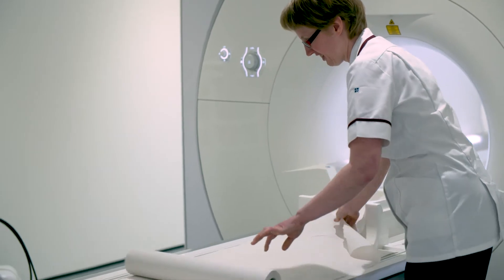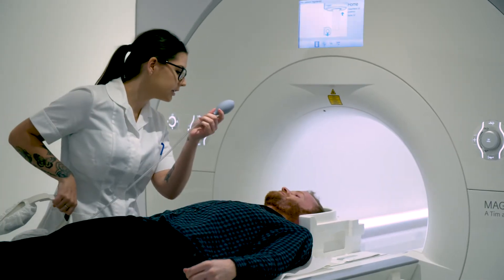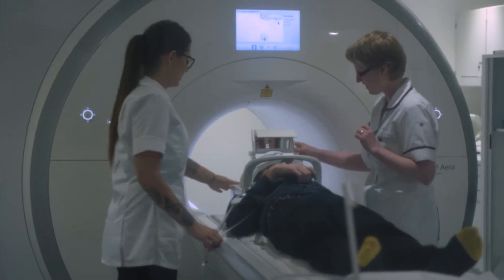Once we're all happy with that, we'll take you into the scanning room, pop you onto the bed, place the correct coil over the body part which we're scanning, give you a call bell in your hand — so if you're nervous at any time you can give it a squeeze and we'll get you straight out. We'll also give you some headphones for the noise, because it will be very loud.